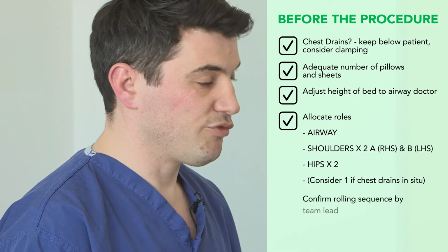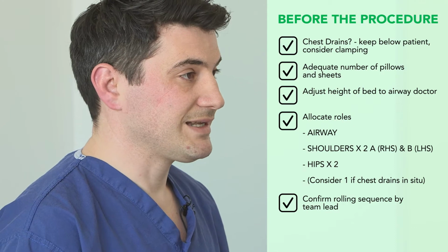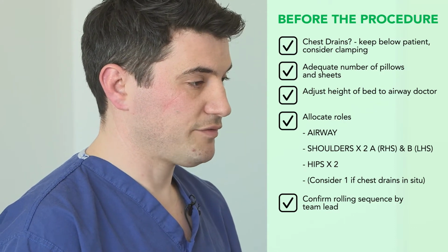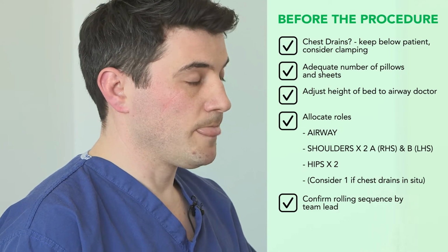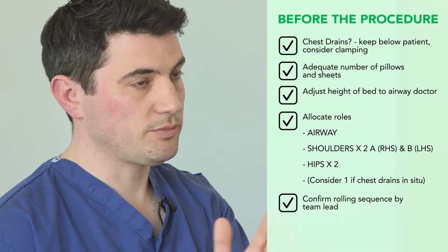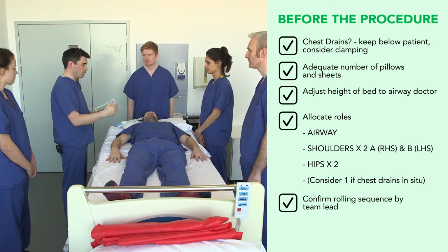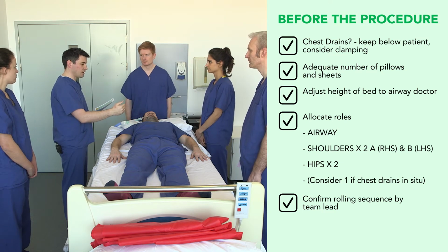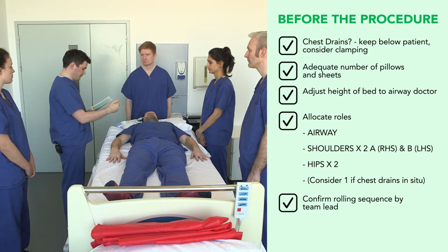So now I'm going to confirm the rolling sequence to the team. So the instructions will be ready, steady, slide, and then we will slide to the left, then ready, steady, roll. We'll roll into 90 degrees. We will then deliberately swap hands sequentially, shoulders first, followed by hips. Then ready, steady, roll into prone, ready, steady, slide into the middle. At that point, we may have to reposition the sliding sheet before moving up the bed.